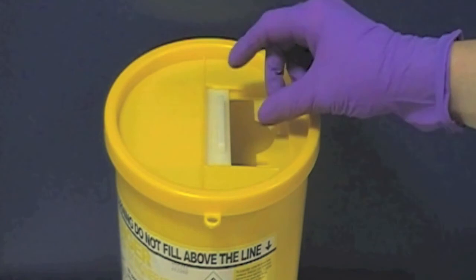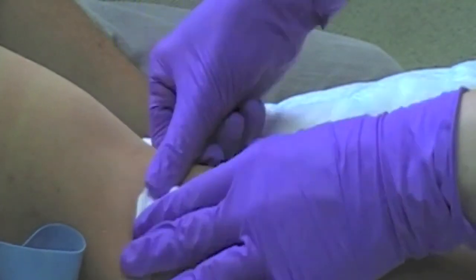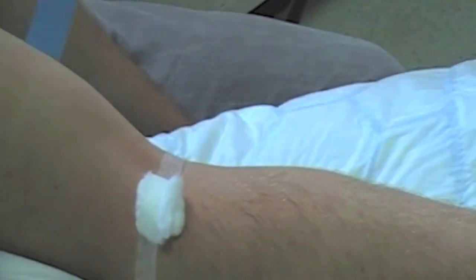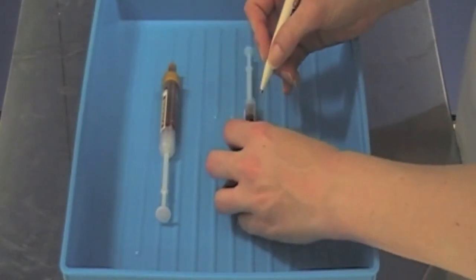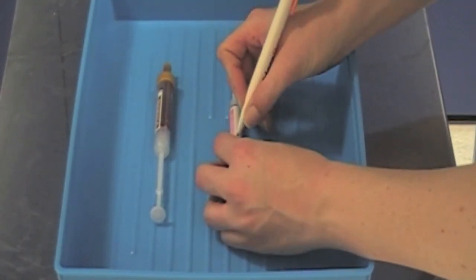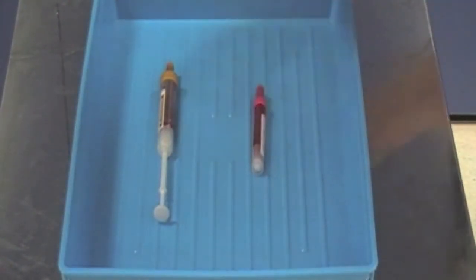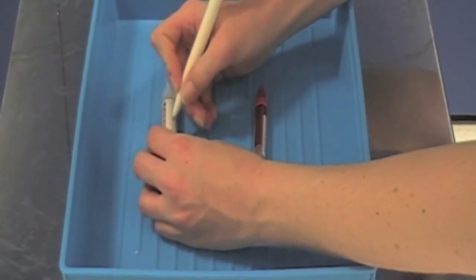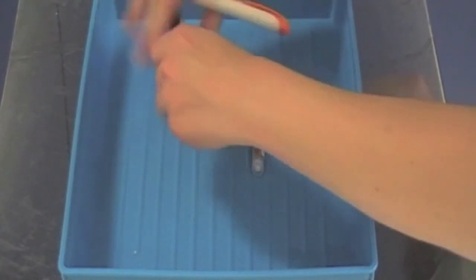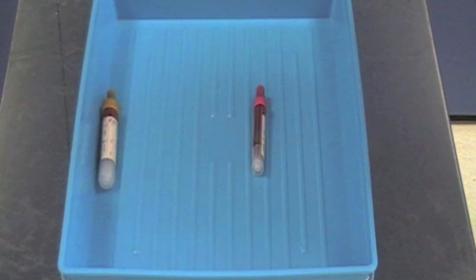Withdraw the needle and put it immediately into the sharps bin. Now apply pressure directly over the puncture site and use a piece of tape to secure the dressing. Now turn your attention to the blood sample bottles — these must be labelled at the patient's bedside. Write clearly and legibly using black ink, ensuring that the ink from your pen will not smudge. Remove the plunger from the bottle by pulling it until you hear a click, then gently snap off the plunger, placing it into the sharps bin. Repeat this process for all the bottles.